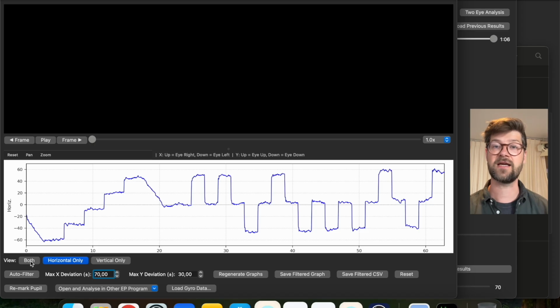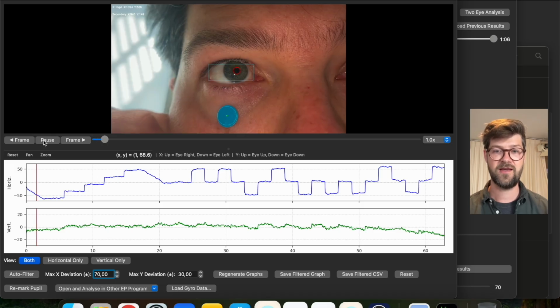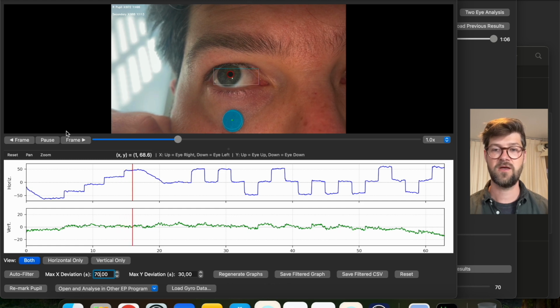And we can check that the video has actually tracked in the way we want it to. So if we press the play button here, see the red circle around the pupil, and the pupil moving, the red circle stays right on it so far. And you can also see underneath the green dot on the blue marker, and that's showing us that it's also correcting for the head position.